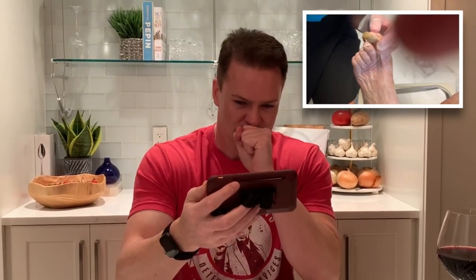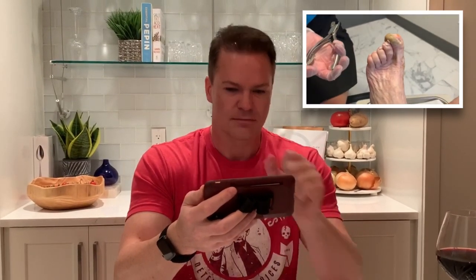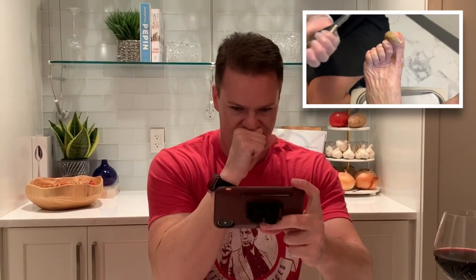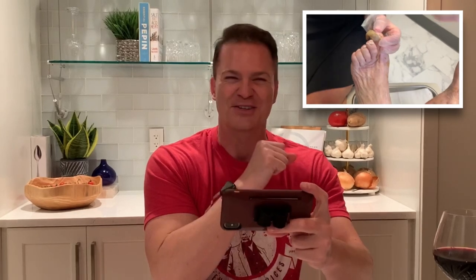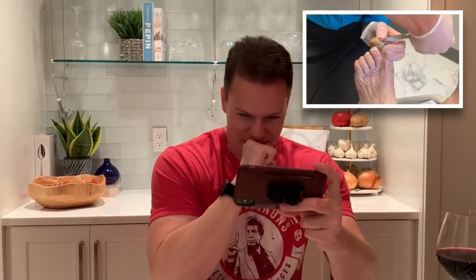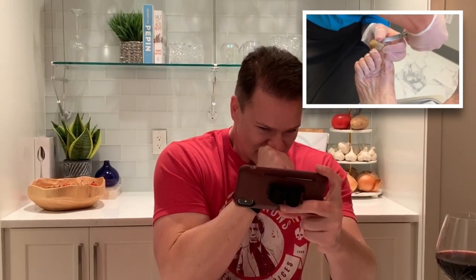Let's see how we can get a hold of this guy. This is called a ram's horn nail - it takes on the appearance of a ram's horn. I'm hoping just to clip a little piece and get it started, because fungus just loves a layer.